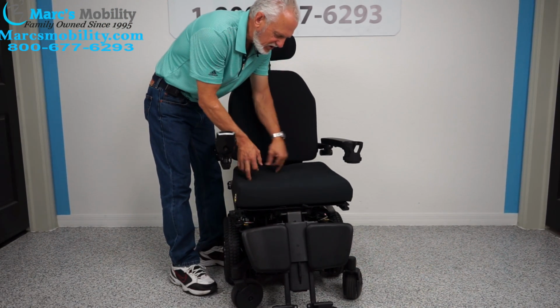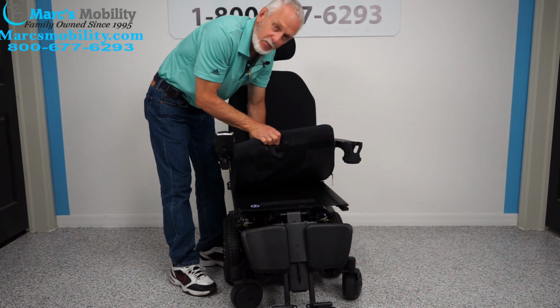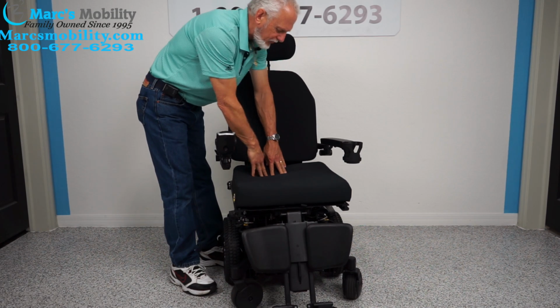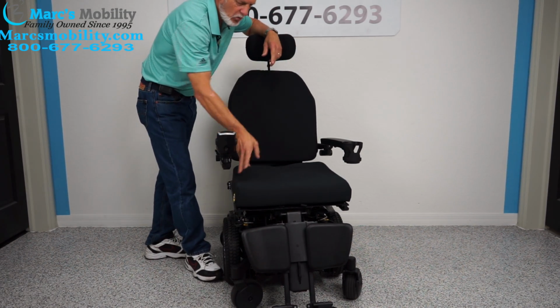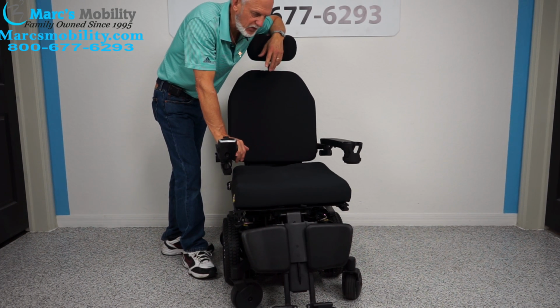Now the seat on this chair is 20 by 20. This is a removable cushion. Again, this is a memory foam cushion with a little bit of gel in the back right here. So 20 by 20 with a large back. So this chair is set up for a fairly large person.